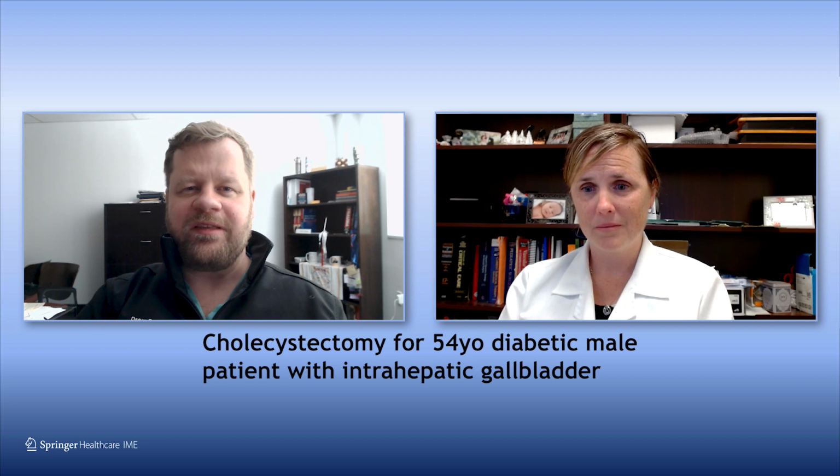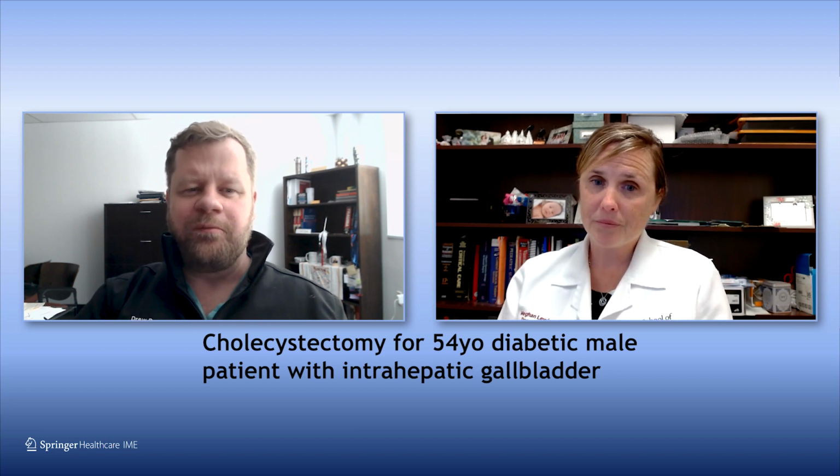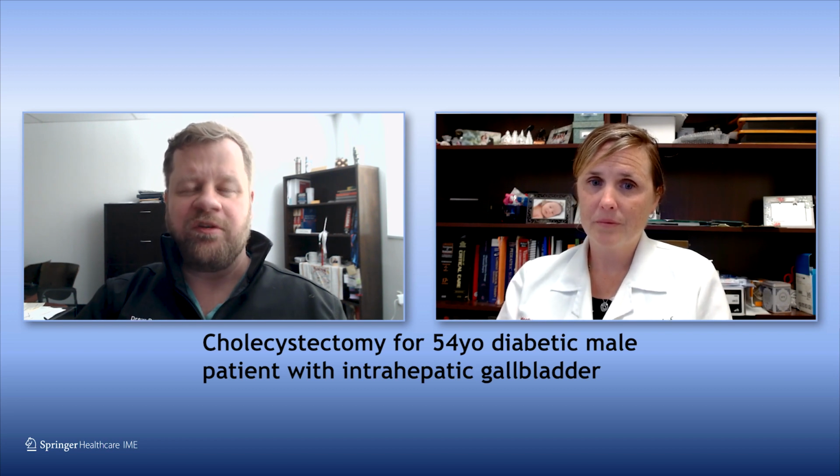Couldn't agree more with all those points. And I think as you alluded to there at the end, the type of bleeding you have, just from good clinical surgical practices, while these agents are extremely helpful adjuncts, looking at the scene there for a few minutes, it's not just an apply and sort of go, but it's actually making sure that in that time frame they're accomplishing what you want them to accomplish, and making sure that there's nothing else surgical that needs attending to before you conclude the case. Because again, these are taking care of that ooze in the patient who has an intact coagulation system, but will not take care of that surgical bleeding, just to drive home that point again.